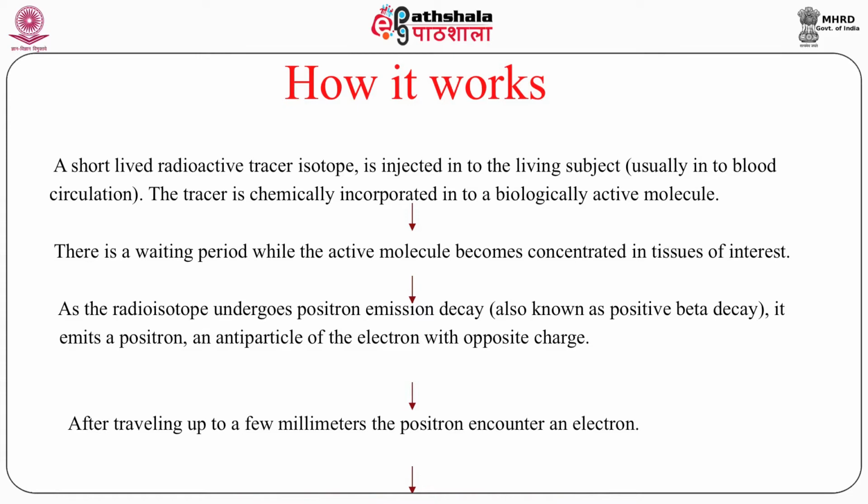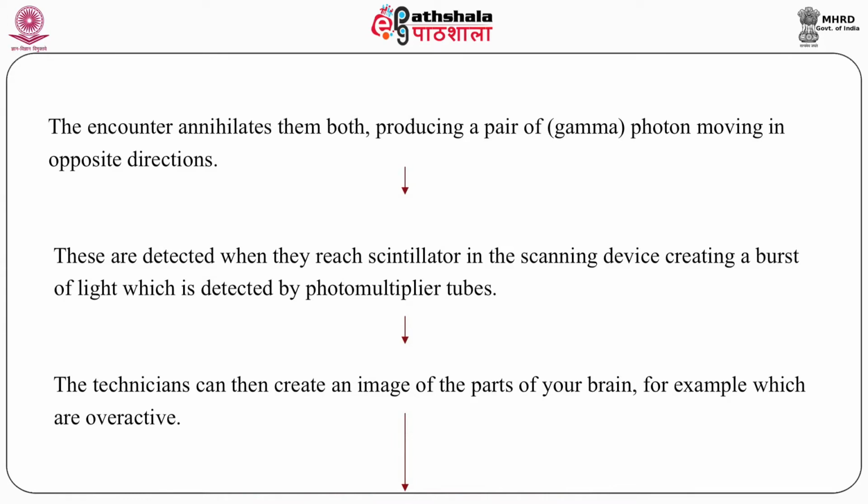Now, fluorine-18 is a positron emitter, and that is what makes it work. Finally, fluorine-18 emits a positron, which moves a certain distance, annihilates with an electron, and finally two gamma rays come out. That is what is written, that after travelling a few millimeters, this process takes place. So when this annihilation happens, two photons are produced, and that is what we are looking for: two photons.